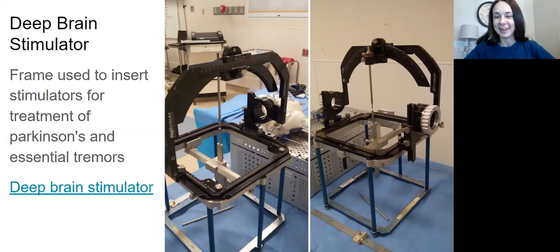So I did all my numbers, I set it up, and it was off. And this was way before the patient was coming in the room. So I scrubbed out, took a picture, so that maybe when the rep came in to help me figure this out and get it correctly, that I would remember my mistake. So my thought process was, let me take a picture of my mistake. So even though it looks like it's ready to go, it's a millimeter off, which is not good enough.